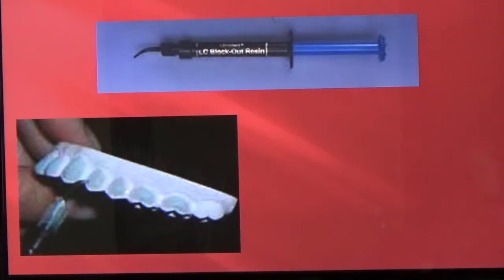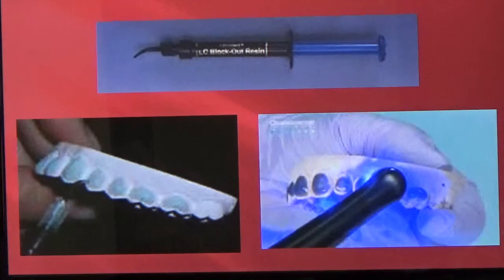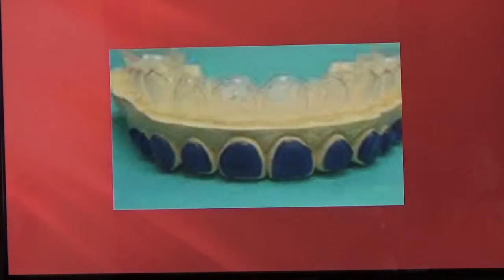It depends on what doctor you use. Sometimes I use block out, sometimes I don't. You put a little veneer, okay, just on the outside of the teeth. And what that's doing is creating a little reservoir, a little space, so that the bleach can stay there. I've done it both ways, and it works both ways. And then you cure it with a light. So again, you just kind of paint the outside of the teeth with just a thin layer. You don't want to put too much. If you put too much, the bleaching tray is going to feel bulky, and the patient will say, "Oh, it feels like I've got too much in there." So you just want a real thin, less than half a millimeter or so, just a thin coating there.